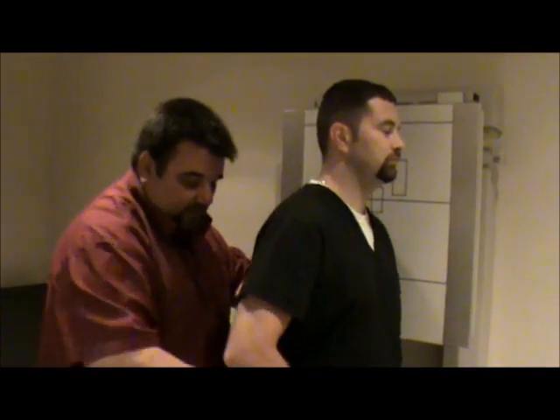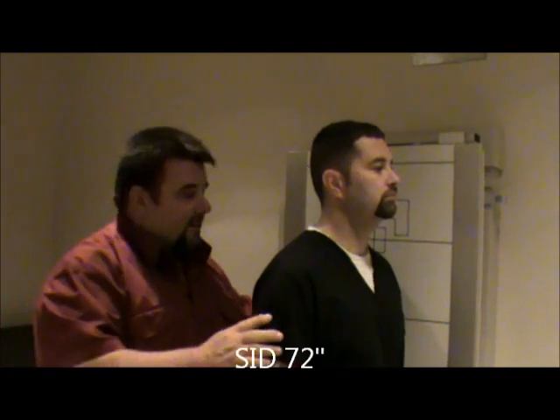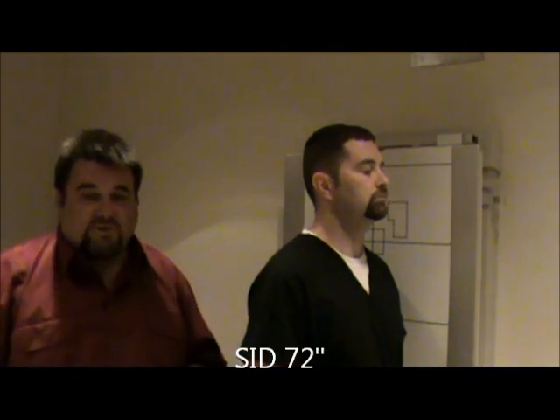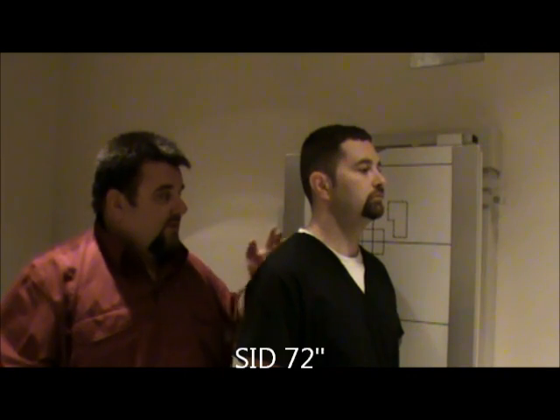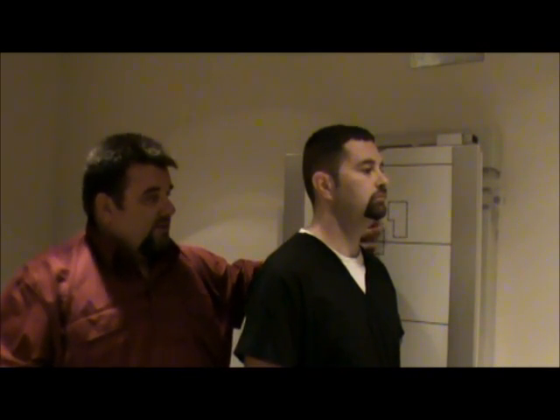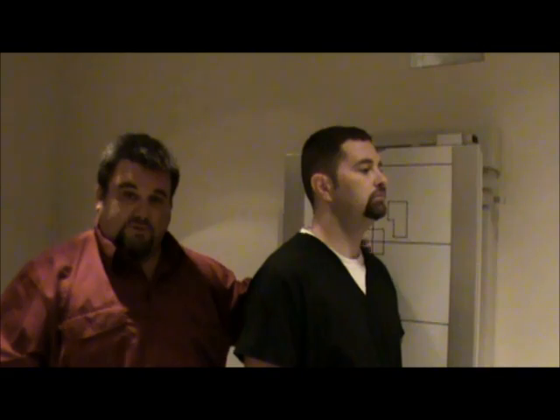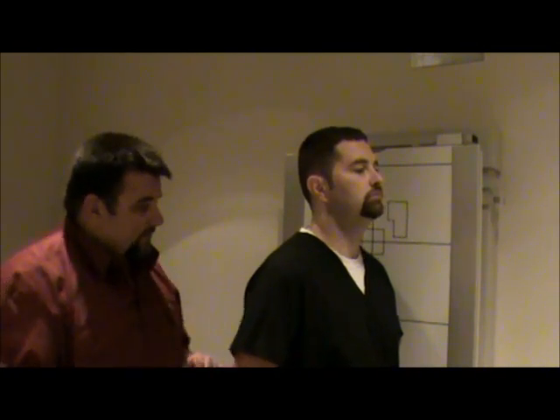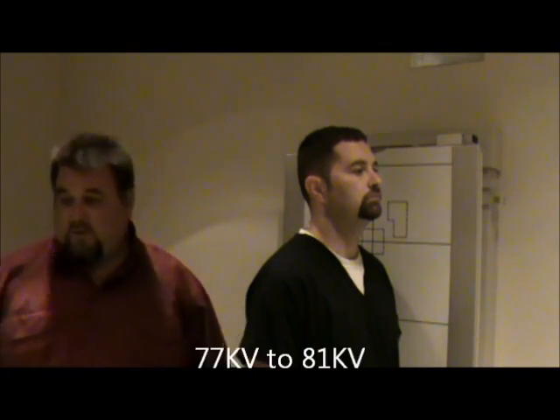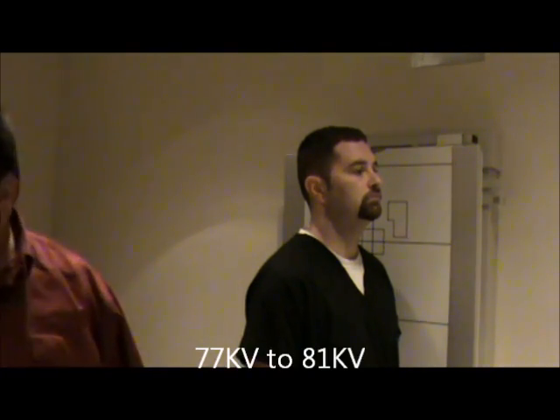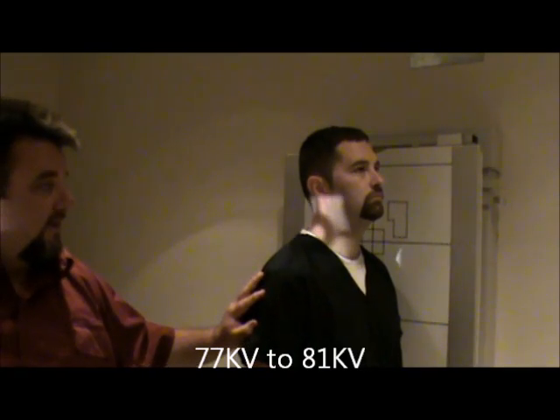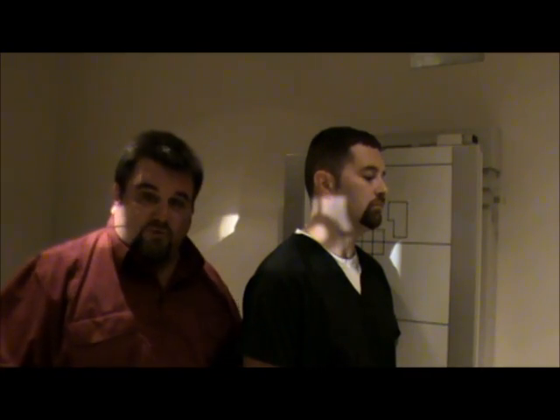We're going to have the patient put their side against the board, so I need to turn the shield to the side. In real world, this patient would not have their necklace on. We're going to use a 72-inch SID, which helps reduce magnification between the IR and the neck, since the shoulder causes increased OID. Technical factors will be 77 to 81 kV. We're going to center up, just like the lateral — that will be considered our neutral.